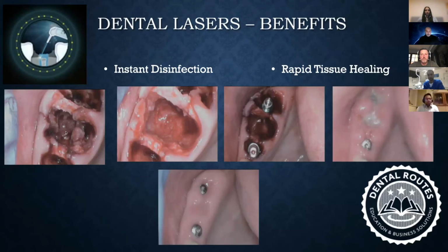Okay. Now, the same scenario today, what I basically do is I pull the tooth out. I have cleaned the whole socket to my satisfaction. Once I've cleaned it, I've been able to place the implant in the socket. So all these three stages have happened in the same appointment, where it would have taken me at least 5 to 6 months before.